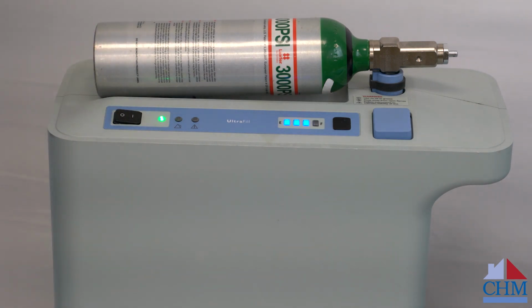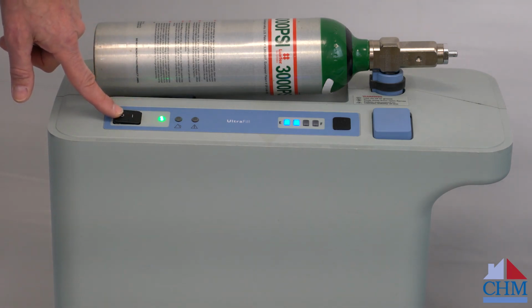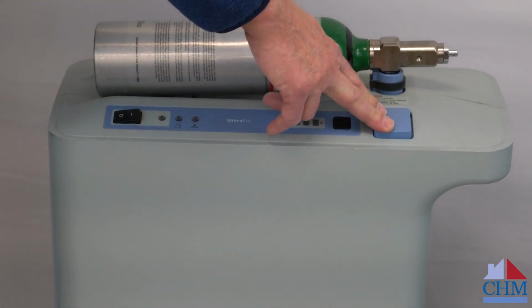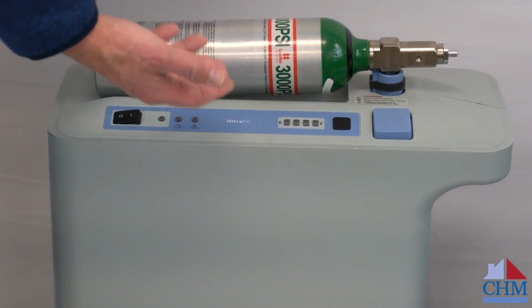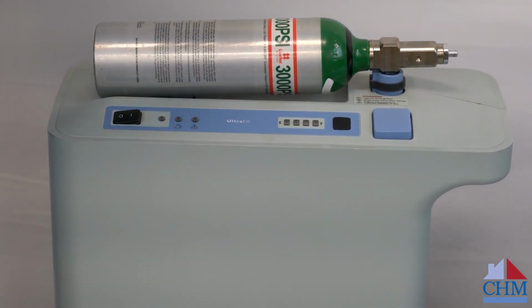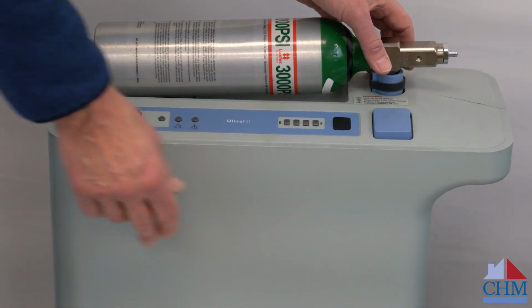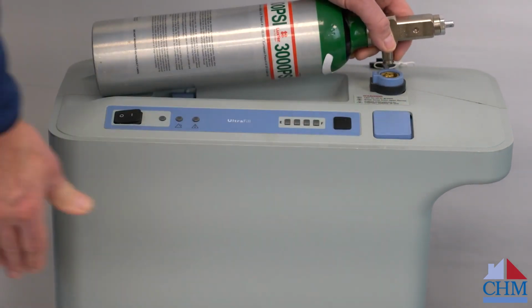So in order to take the tank off, when we're done, I'm going to shut off the compressor. Let's say it's full at this point. Then I can push this button right here. And by pushing this button, it's going to release it. And because I've started to fill, there's going to be some back pressure to it. So be ready, have your hand over the tank, give it a push down, and it'll pop right off.